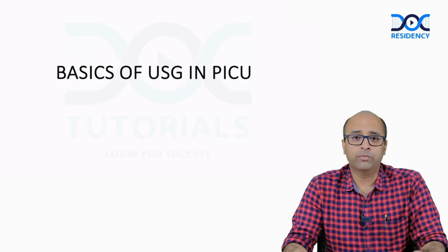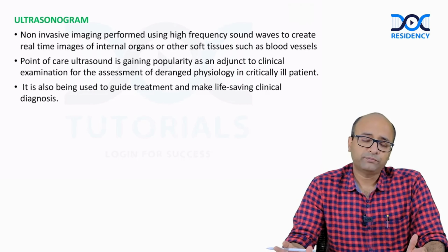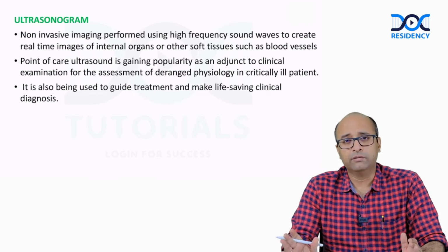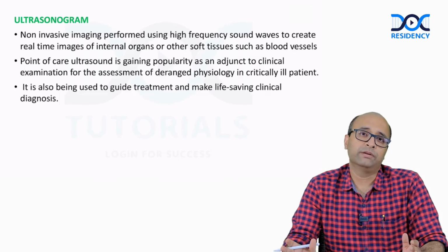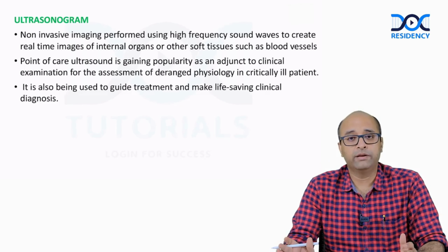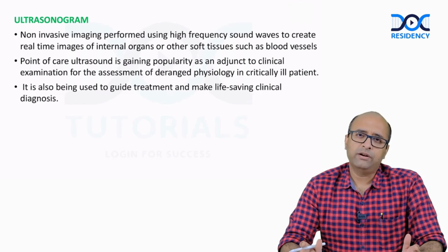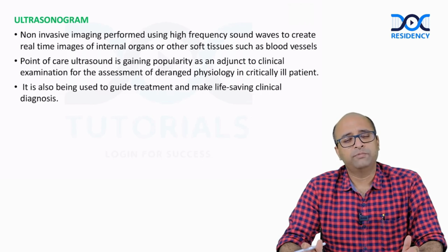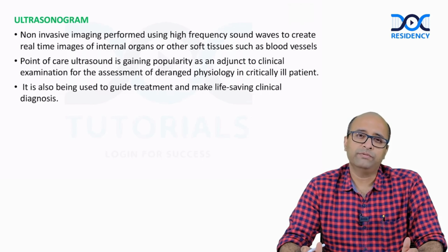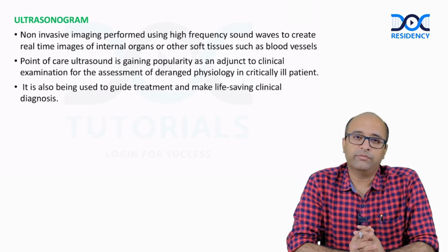Today we are going to talk about basics of ultrasound in pediatric intensive care unit. Now, we all are aware that in the last decade, the most important progression in healthcare advances for critical care is usage of ultrasound. Ultrasound generates non-invasive imaging and it is performed by using high frequency sound waves to create real-time images of internal organs or other soft tissues.